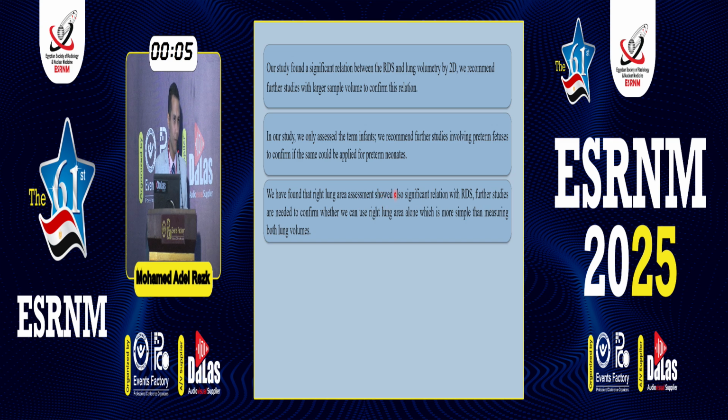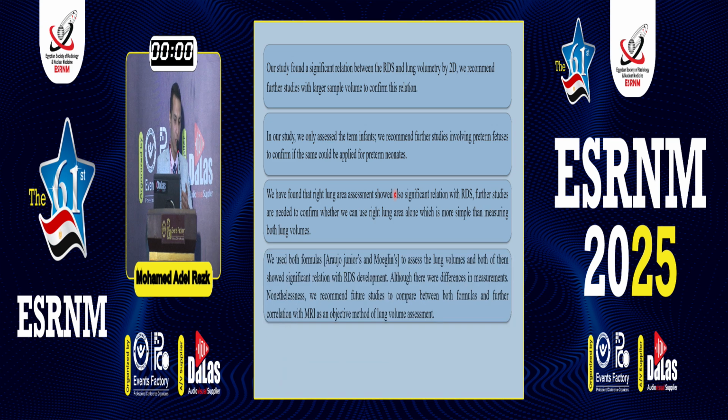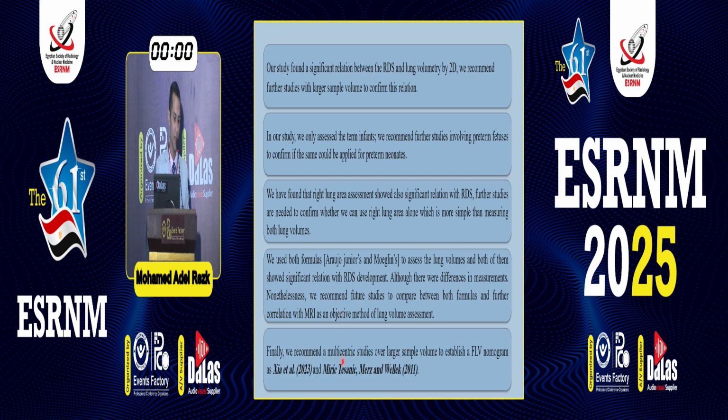The third is we found that the lung width and area individually showed significant correlation to the fetal respiratory distress. So we recommend further analysis to establish those hypotheses. And we also used Arroyo Junior and Moglen's formula. So also a good idea would be to investigate which is more significant and which is more accurate. And this would happen if we compare it to an objective study such as fetal lung MRI during pregnancy. And this is what I said before, to establish an Egyptian nomogram for all the fetal measurements, lung, heart, femur length, and so on.